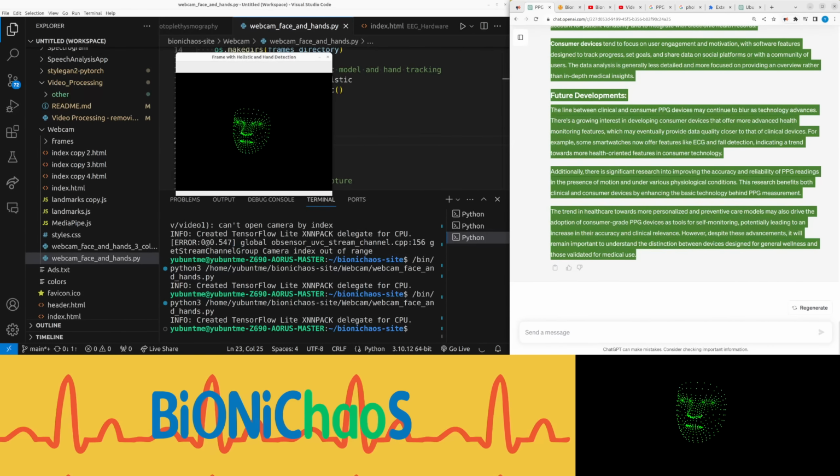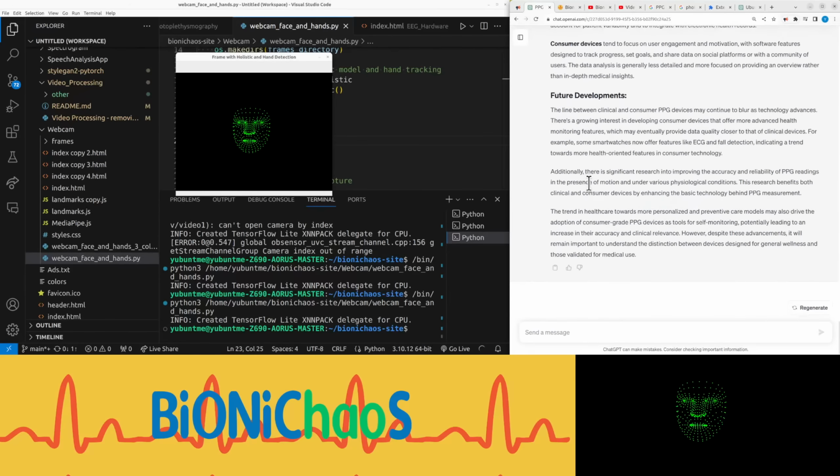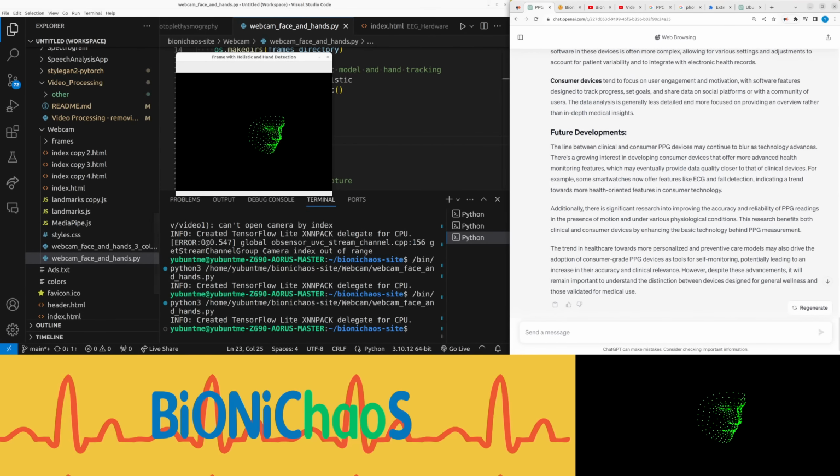Photoplethysmography, PPG, is a simple and low-cost optical measurement method that is often used to detect blood volume changes in the microvascular bed of tissue. It is non-invasive and can be used to monitor heart rate, blood oxygen saturation, and other cardiovascular metrics. The principle behind PPG is that blood absorbs light more than the surrounding tissue, so by shining a light source, usually LED, onto the skin and measuring the amount of light either transmitted or reflected, one can gauge the blood flow dynamics in the tissue.